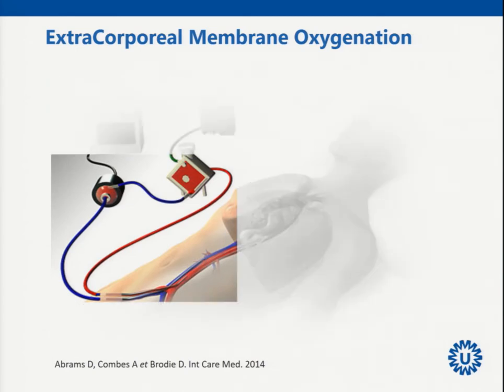What you see here, and that is actually a unifying thing in extracorporeal support with ECMO, is that you drain venous blood from the central venous circulation. It does not matter how you cannulate, VV, VA, VAV, Fabio Taccone will touch on that in the afternoon session. So you start with drainage of central venous blood in every situation.